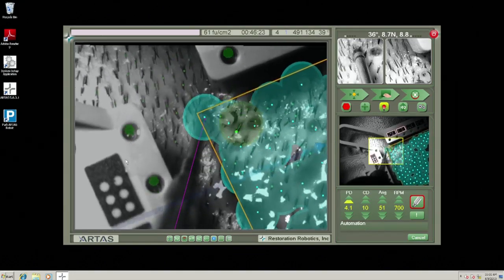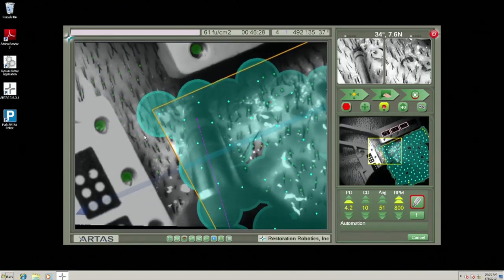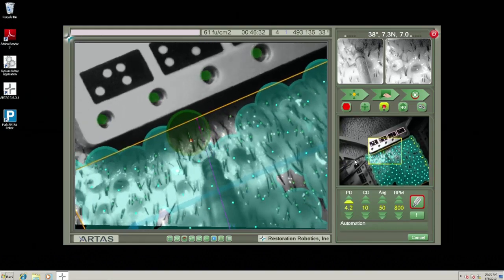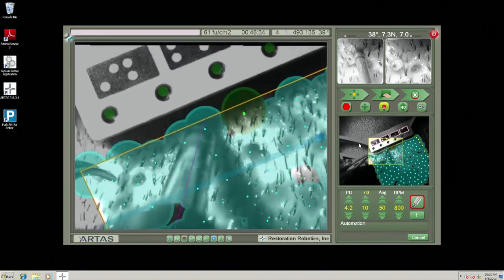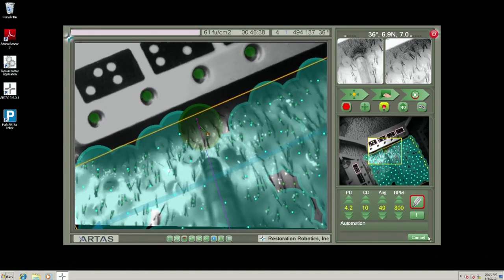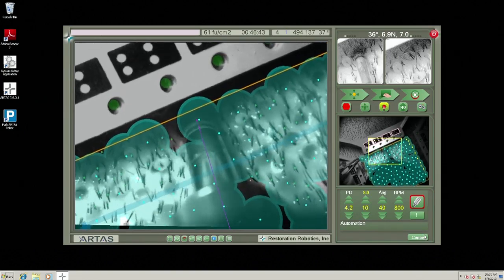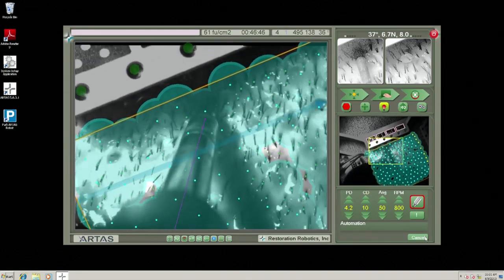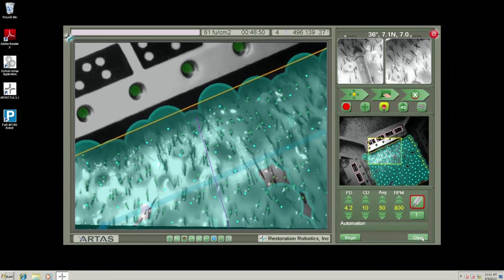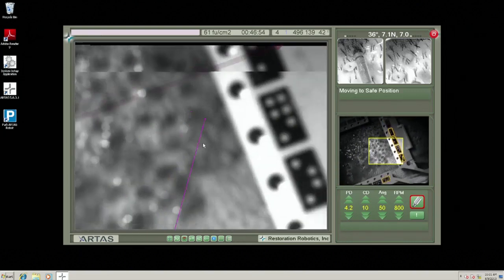Hypothermosol from our current contract costs me about $160 for 100 ml. A 12-ounce can of Coke is about 355 ml, so it's about 1/4 of a typical soda pop can in the United States. So it's a very, very small amount. Now, from my distributor, I know that normal saline costs me about 97 cents for a liter. So there's no comparison in cost. It does add cost, but you're going to get a better transplant at the end of the day.